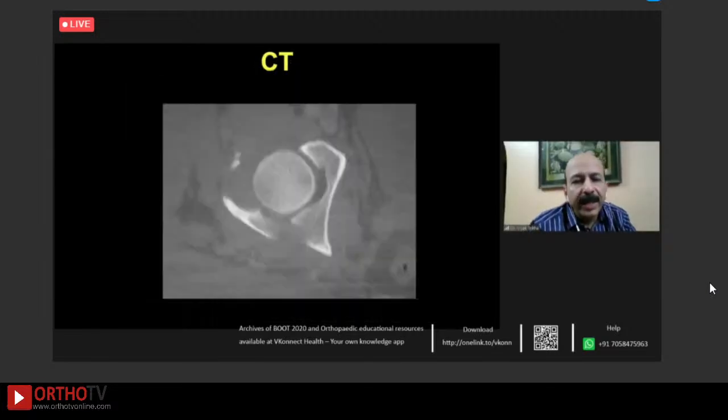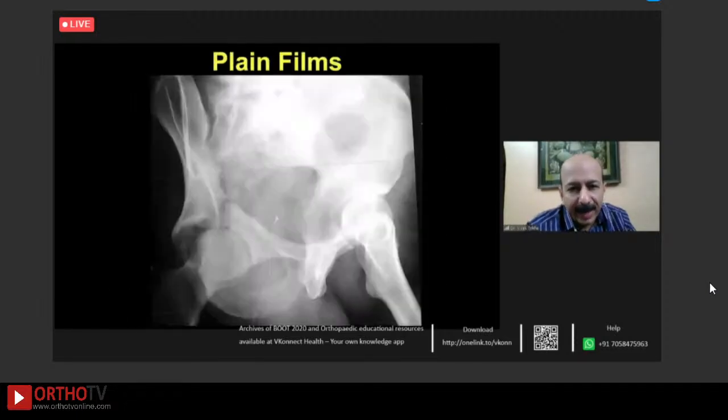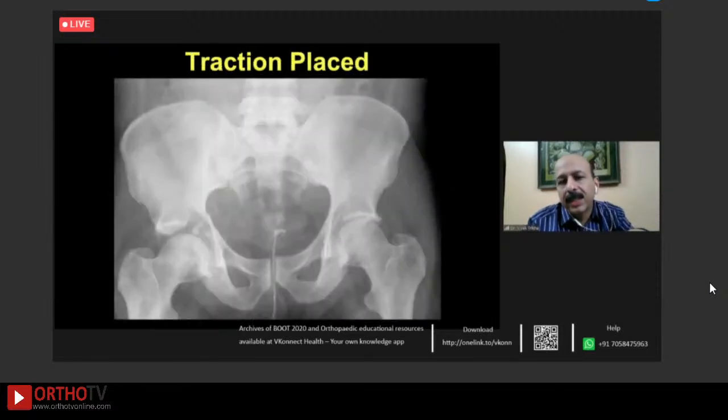In my hands, if it is a very high fracture, these transverse ones which are very high, the transtectal ones, I would like to go from an anterior approach and use it with an ASIS osteotomy, combining it with a Smith-Petersen sort of approach, so that I can medialize my psoas much more. It helps me get the external rotation of my iliac fragment back into its place properly, which I can visualize from my anterior visualization of the SI joint with a Schanz pin in the iliac crest or the ASIS, which I can derotate.